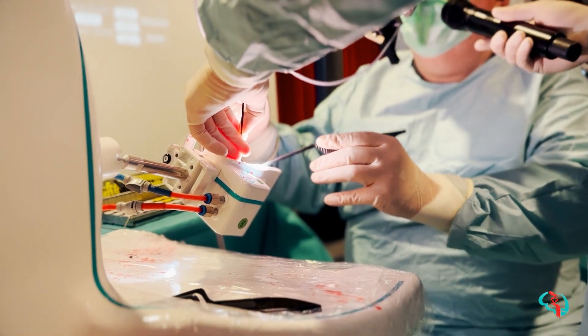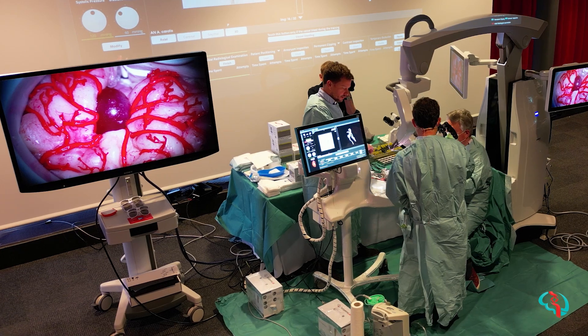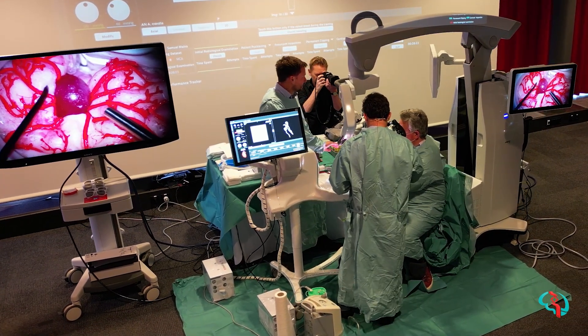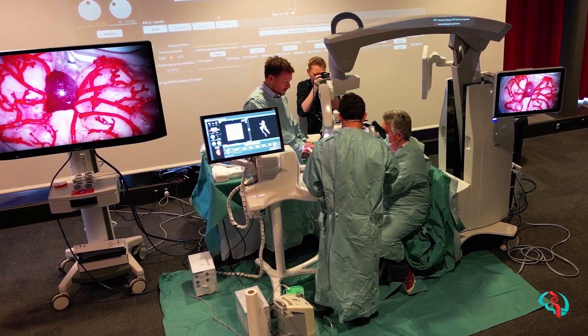I put a clip on what I thought was the M1 — it turned out to be the M2. But the simulator made me think: why is it still bleeding after I've clipped the M1? Could there be backflow through the M2s? Which is the sort of process one goes through in reality to understand why you haven't trapped the aneurysm. And then ultimately we were able to get a clip on the M1 and finish off the clipping to have control of the situation, and from there clip the aneurysm in a controlled fashion.